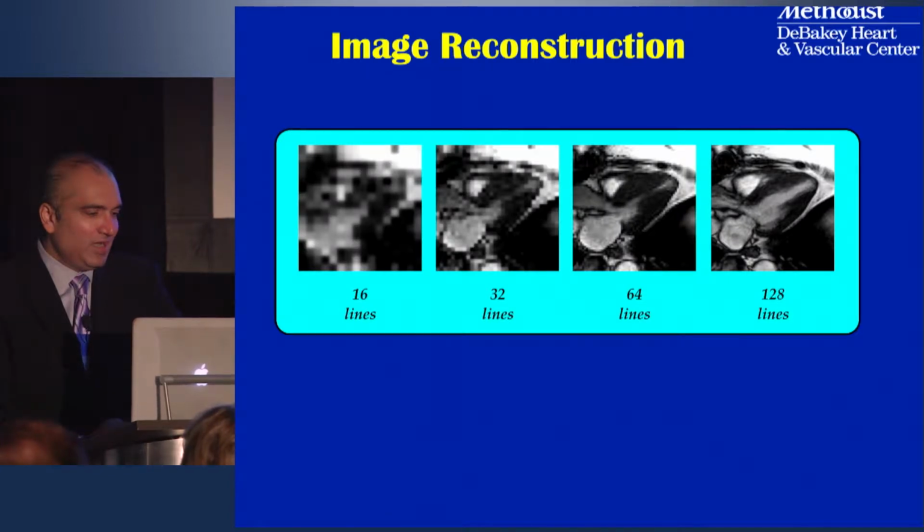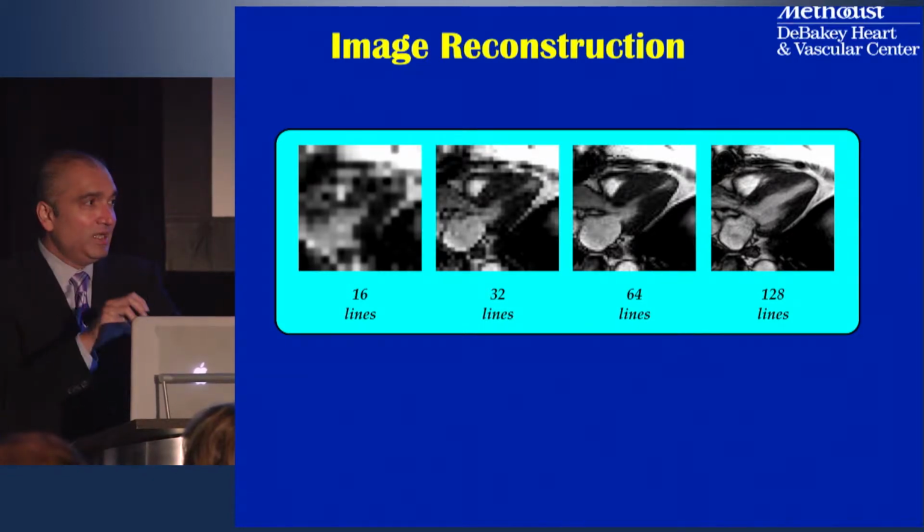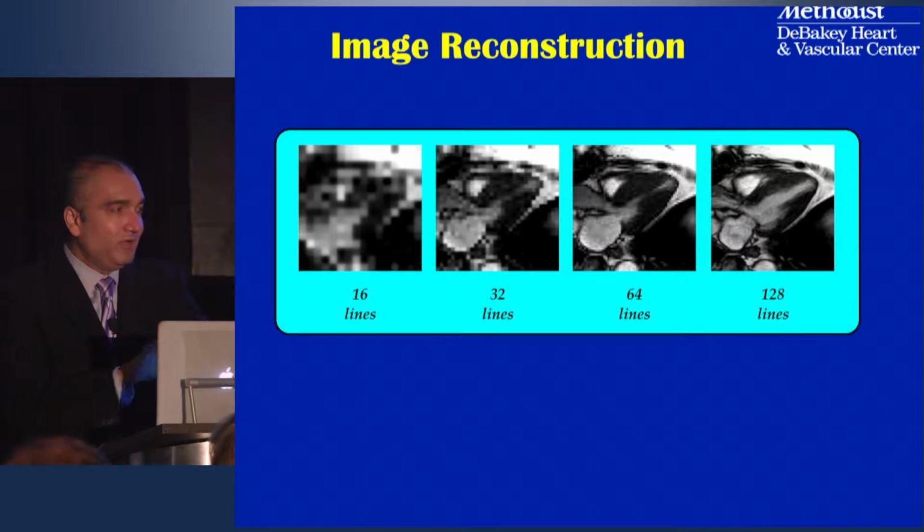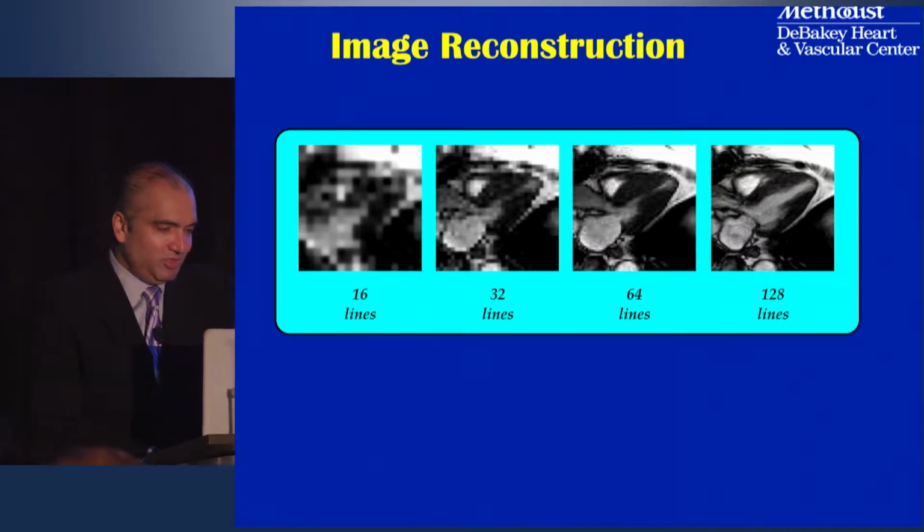And so this is just showing that concept again, which is if you reconstruct the images based on the data from just one single heartbeat, it looks like the image you see on the left-hand side. And if you do it over 4 to 6 heartbeats, you now get the image on the right-hand side. And so as a result, we're not obtaining separate parts of the imaging field of view. Rather, every line of data somehow contributes to the image.